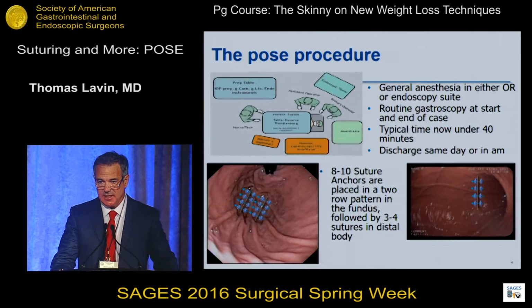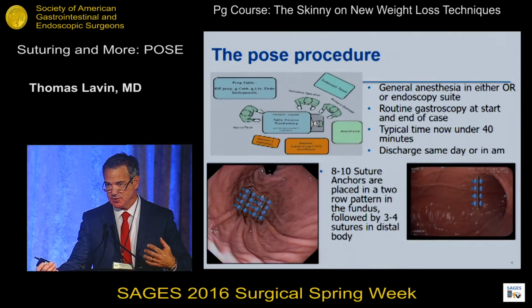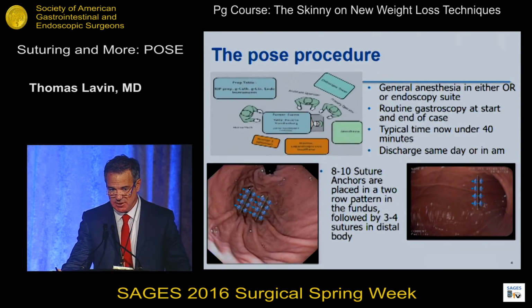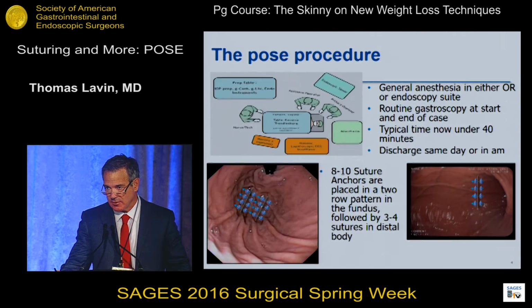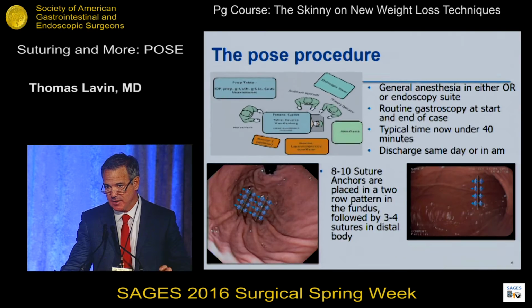This is basically the setup of the OR. It's a little bit of a confusing slide, but it's done under general anesthesia. You see that the surgeon and the assistant are at the head of the bed, with anesthesia. It is general anesthesia, like I said. It's done in under 40 minutes. We typically do the procedure in about 20 minutes, so it has a pretty quick learning curve and is a pretty predictable, quick procedure.